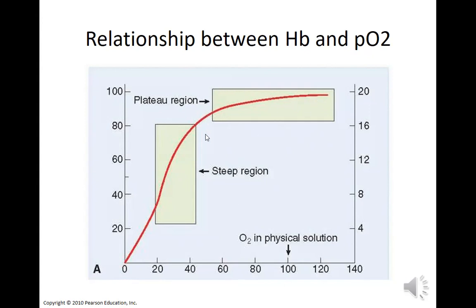By the time it gets to the veins, the venous system, then the oxygen is dumped off, but it's still 75%. So I mentioned before, hemoglobin has 4 binding sites for oxygen. So when all 4 are bound, that's 100%. When 3 out of the 4 are bound, that's 75%. So it's never without oxygen, unless there's a pathology. Yeah. So the steeper region is venous blood, right? Yeah, very good. It is. Makes sense. Like when you think about that, when you do your O2 sat.